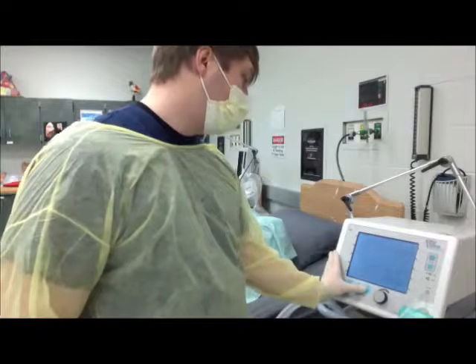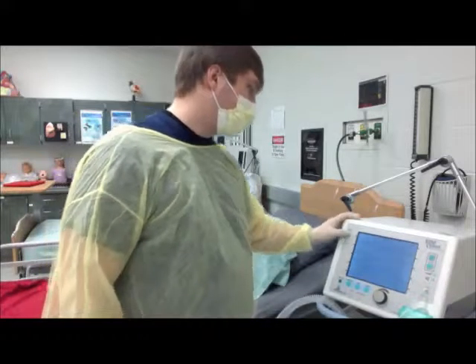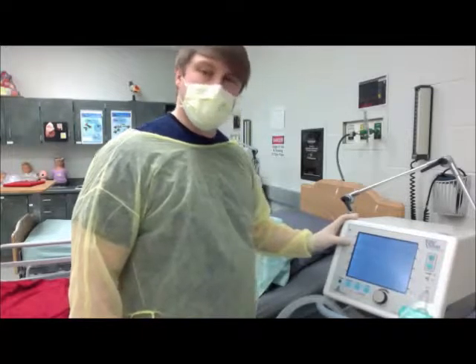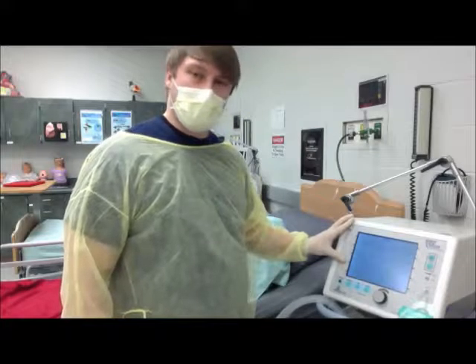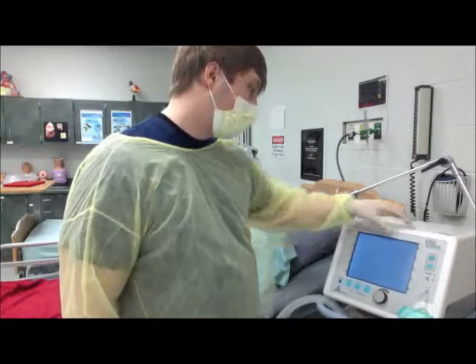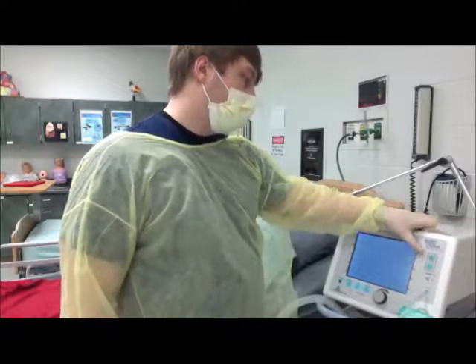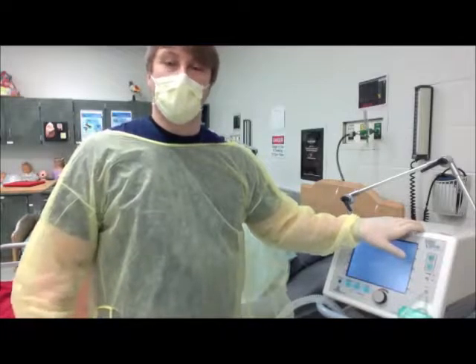Second thing we want to do is go to our alarms. So we got our high pressure alarm, we want to set that 10 above, and our low pressure 10 below, whatever she's getting. Our apnea is always about 20 seconds. Our low minute ventilation is 1 below, and the high rate and the low rate is going to be based off of whatever the set rate is, or whatever her rate is.